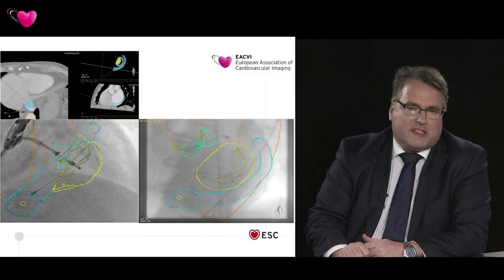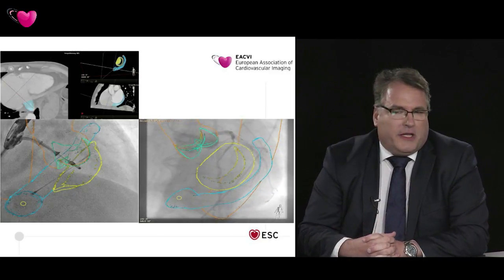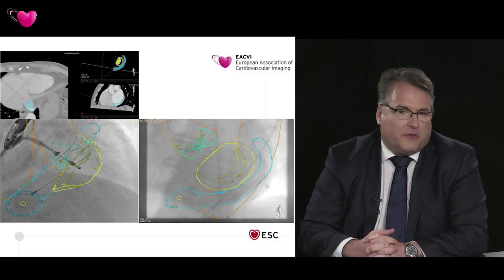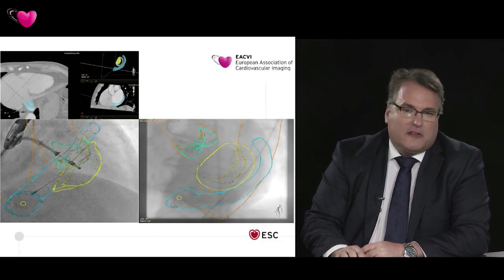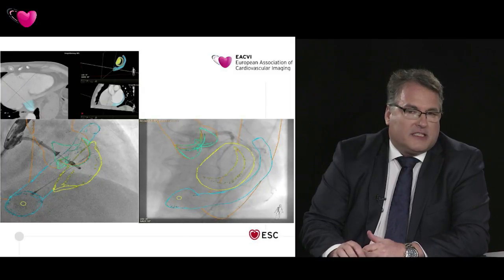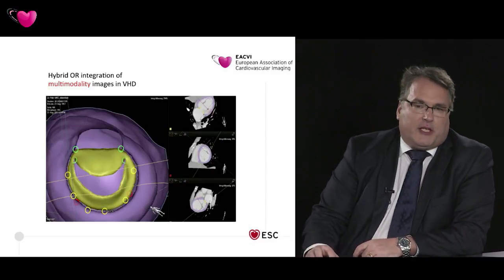And if we extract this information into fluoroscopy, you can see here that we not only know the distance to the coronary arteries, but we know the height of the annulus, here given by an indirect annuloplasty with the Carillon system, but also a MitraClip. And this is a total transcatheter-based surgical solution. It's an annuloplasty and a leaflet edge-to-edge therapy, where we know in surgery this is more long-lasting than singular therapies, especially in dilated annulus. And we get very precise image information, and this is shown here.